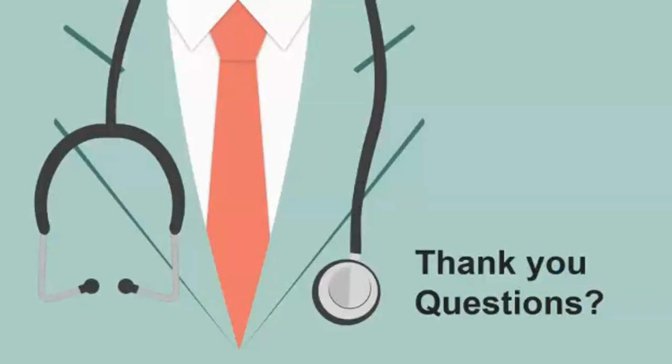I wanted to say thank you very much, Tayla, for being brave and giving us this talk. It was really awesome. One point on your videos of the left and right upper quadrant, you mentioned both of them were indeterminate because we weren't able to visualize the one pole of the kidney. It's actually the inferior pole of the kidney that was absent from both of the views, not the superior pole. Yeah. Okay, sorry. No, that's okay. It's just a technicality.